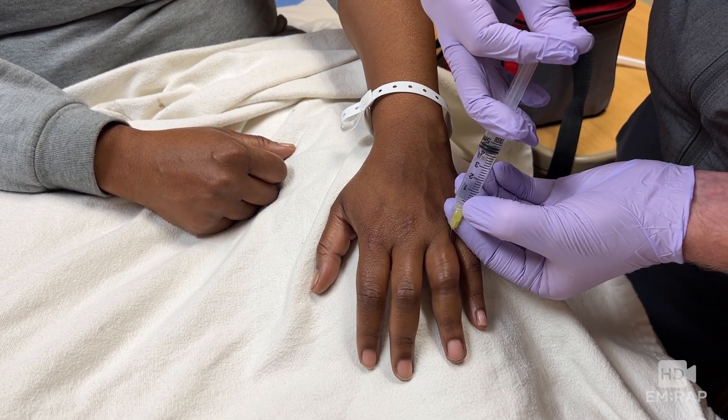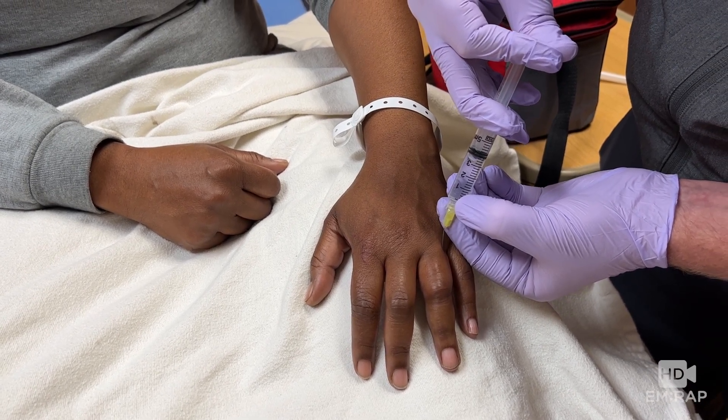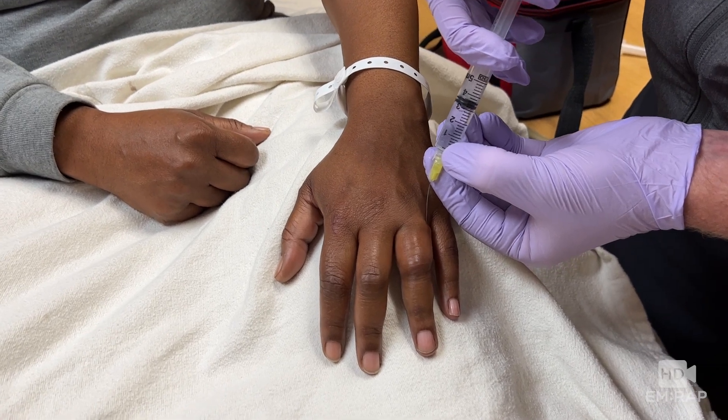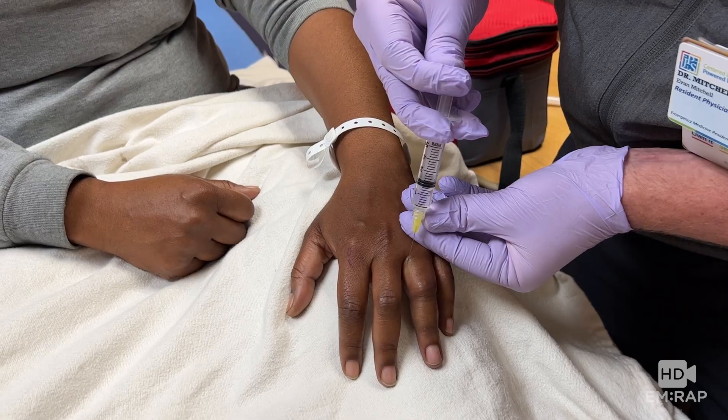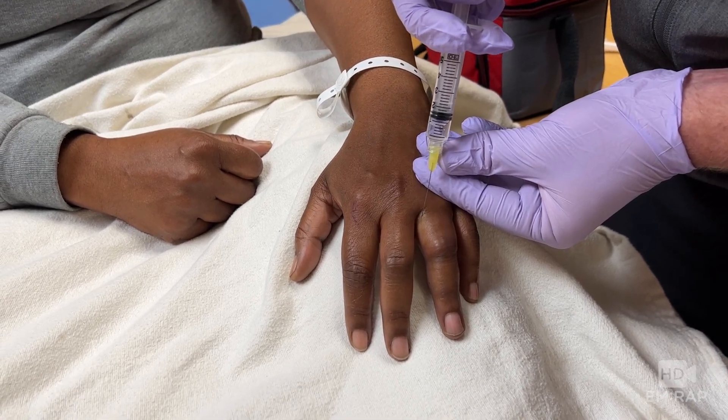We're not trying to skewer the finger. Aspirate and inject two to three mLs of anesthetic as the needle is withdrawn. This allows you to reach both the volar and the dorsal nerves with one injection, except you have to do a second injection because you have to repeat this on the other side of the finger — that's the downside.